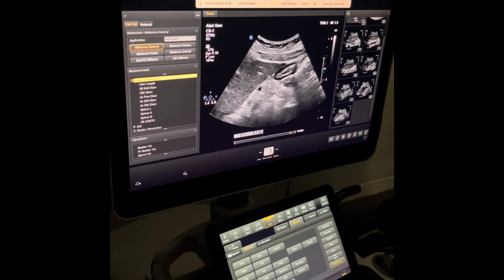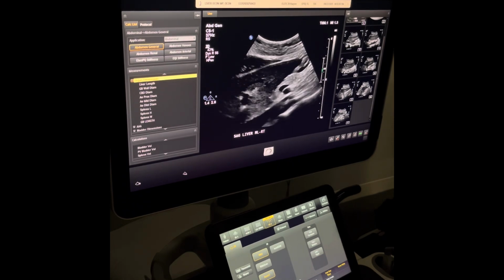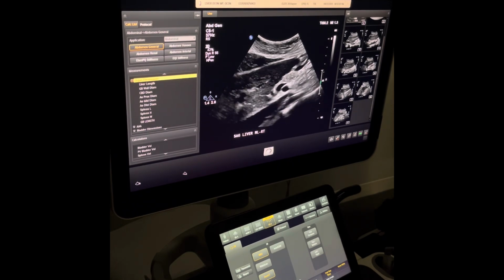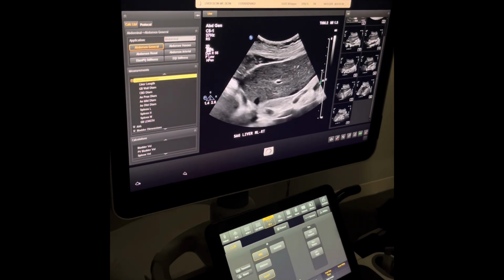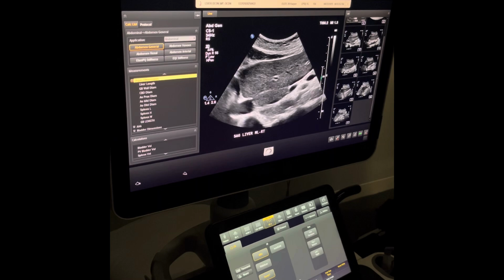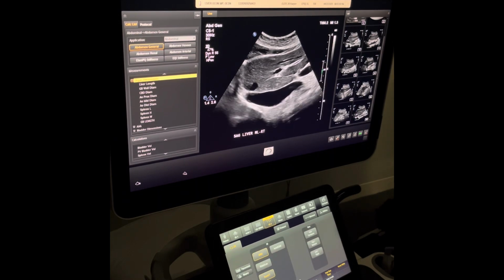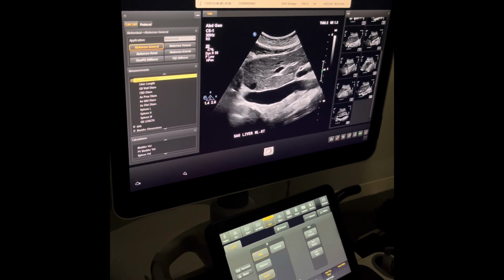And now I'm going to begin my midline to right sweeps. So I'm going back to that caudate lobe. Take a deep breath and hold when you're ready. I'm going to increase depth just a little bit. So we have caudate. I'm going to the level of IVC, and I like to increase depth a little bit more, just so we're really getting any tissue that's beneath the IVC.